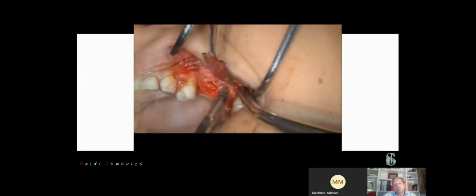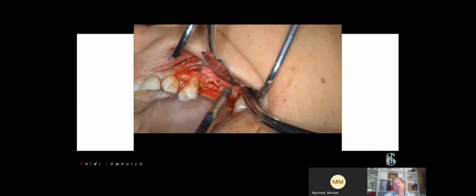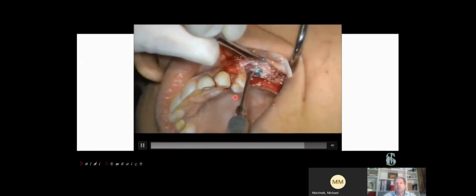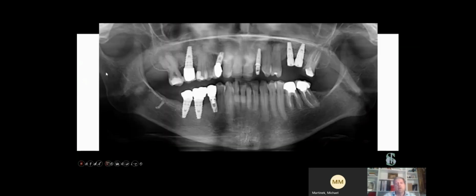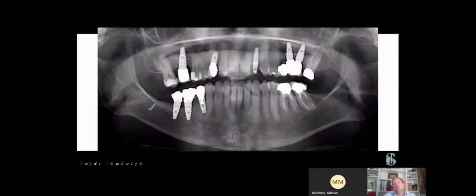Instead, in the posterior part, it's enough to use the implant site tips directly in order to prepare and to enlarge the bone. Look at here. If we have this kind of situation, we can place our implant, we can place a membrane, and then we can finish our surgery. We wait for the healing of the hard and the soft tissue, and we can finish our prosthetic rehabilitation without problem.